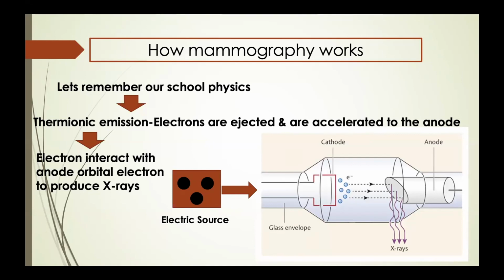We call that X-rays. It could also be that the high energy electrons are passing close to the nucleus, and they encounter some kind of nuclear force that slows them down, that brakes, like when you press the brake of your car, it decelerates and it loses energy.